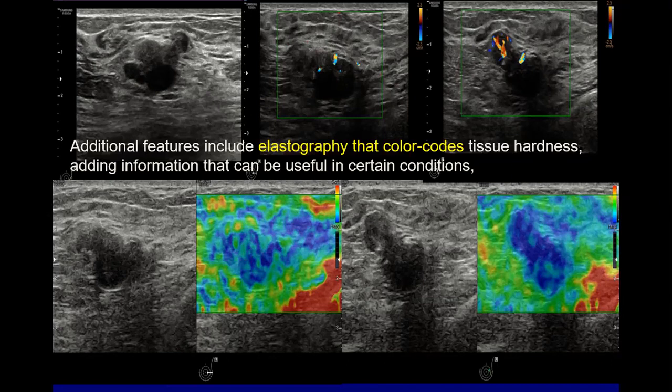It was just a focal fibroadenosis. It was not a cancer. This is my patient. We reported it as BIRADS 4A because it demonstrated minimal increase in size and more or less stable characteristics over time, so we reported it as BIRADS 4A and biopsy.